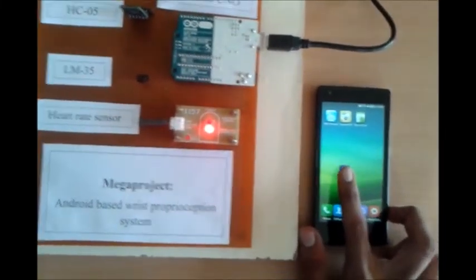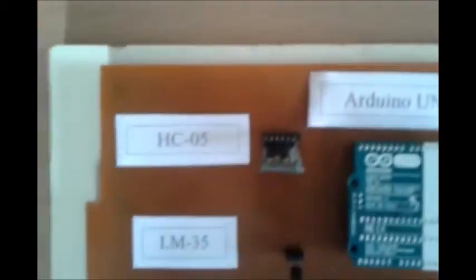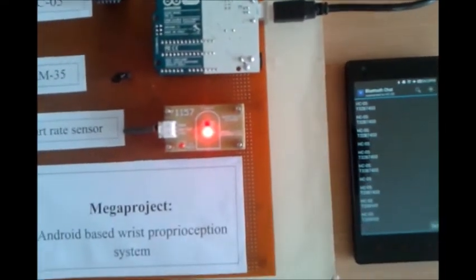This is our application, so we have opened it. It is asking for permission to allow the Bluetooth. I have allowed the Bluetooth permission. Now let us start with the connection. This is HC05 shown here. This is the MAC ID of HC05. Now here we can see the HC05 is blinking twice. That means it is not blinking continuously as it was, so it is connected to our device. Now let us see the view of our Android application.